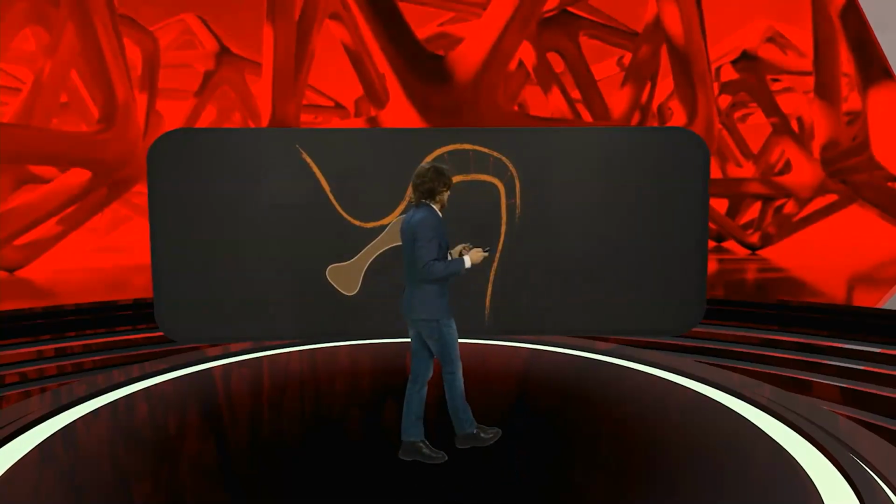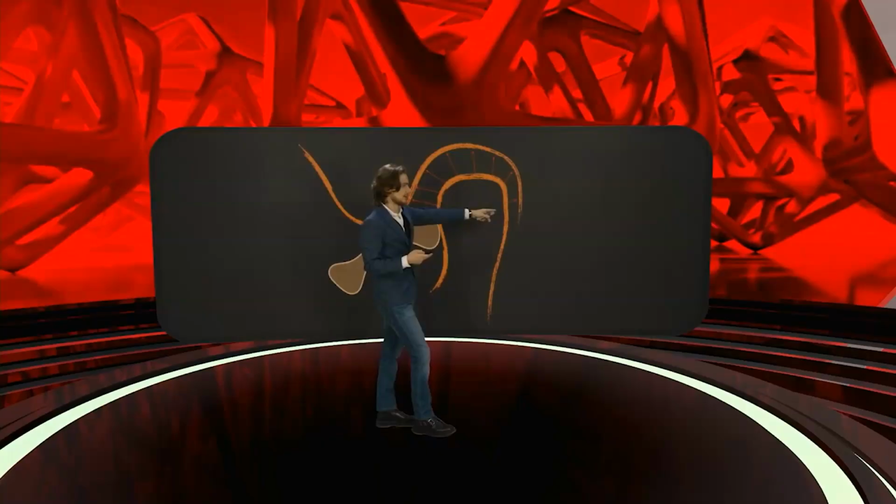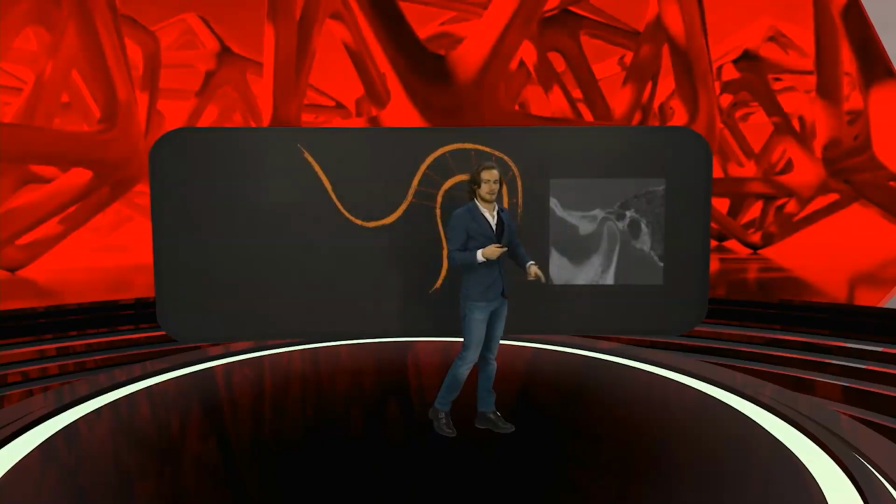And coming back to our disc, the disc may be either compressed or maybe squeezed out forward, but sometimes the disc that goes forward pushes the condyle backward. Like in here, what you see, and this is what you can see on the CBCT.